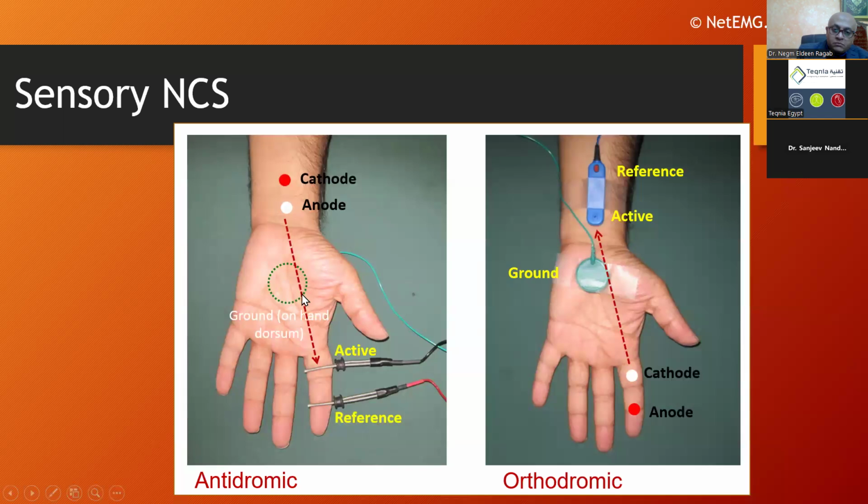But this portion, which is distal to the carpal tunnel, will be normal. In a patient with polyneuropathy and carpal tunnel syndrome, your latency will be increased over here, but when you look at the difference in the two segments, you will see it is not 50-50. It is more in the proximal segment than the distal segment. So that's the 14-7 centimeter technique.